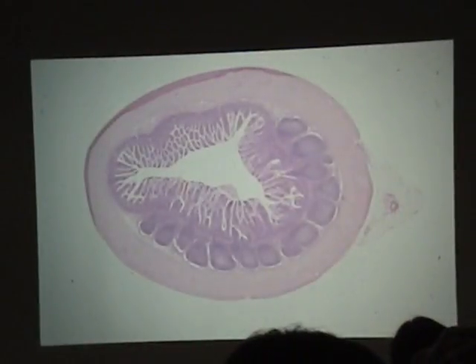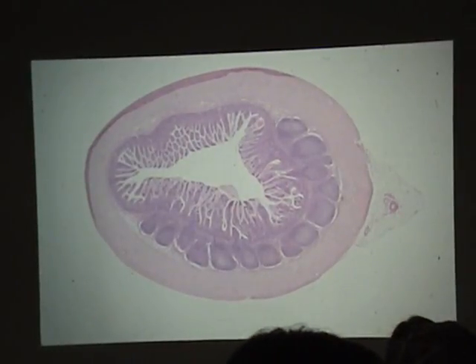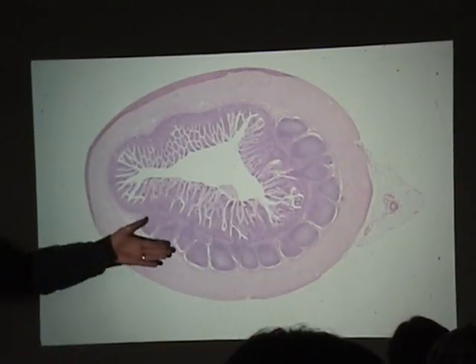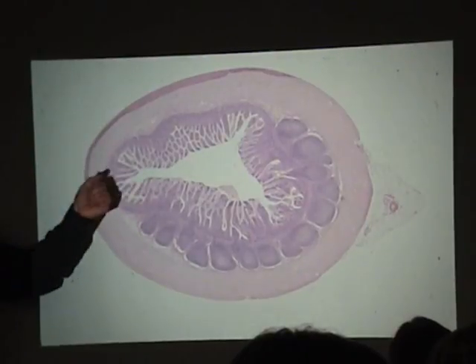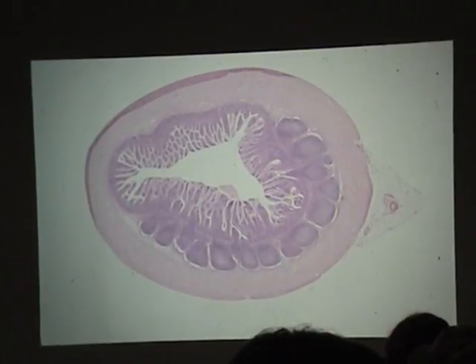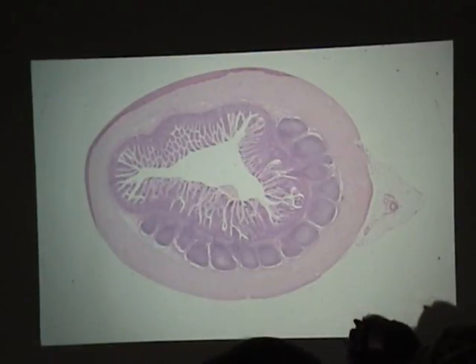Okay, on to lymphoid tissue. We are clearly looking at several things. Peyer's patch. Peyer's patch would tell us we're looking at what region of the small intestine? Right. And we know it's small intestine because we can see all these finger-like projections, which are villi.